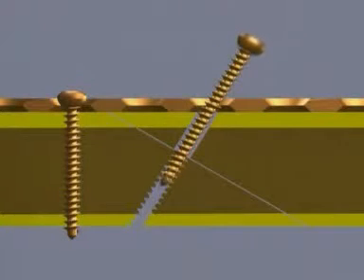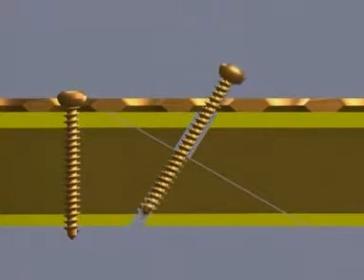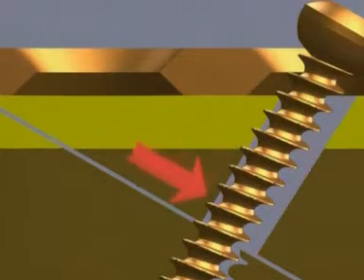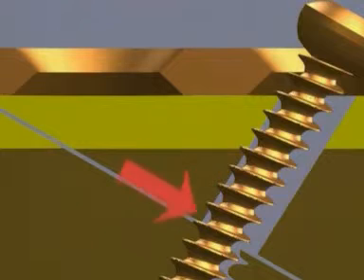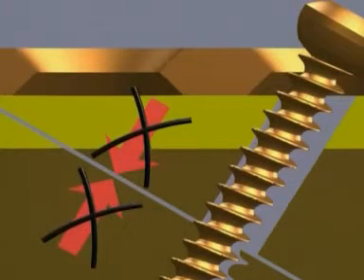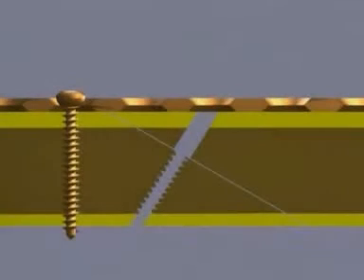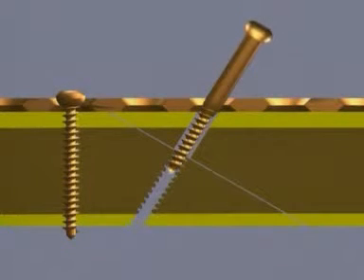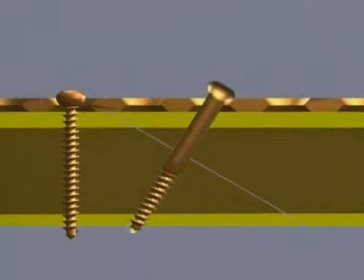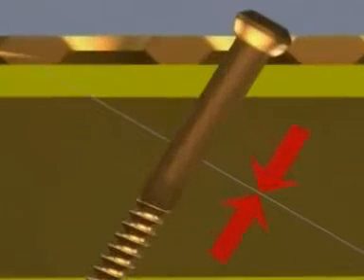Although a gliding hole is drilled into the cortex nearest the plate, the thread of the screw catches in the cortex. The result is reduced compression. With a shaft screw, it does not catch in the cortex. This can bring about an increase in compression of up to 60%.